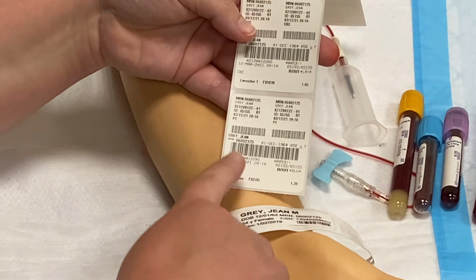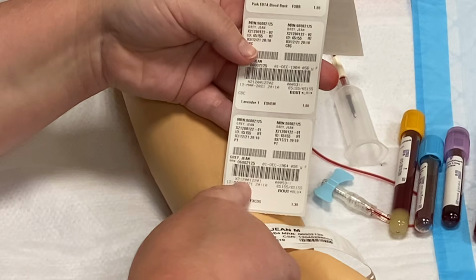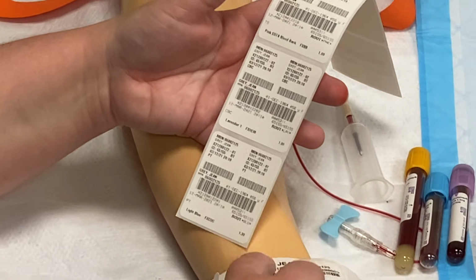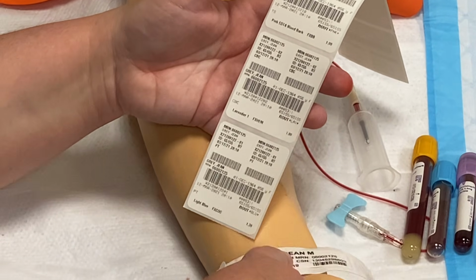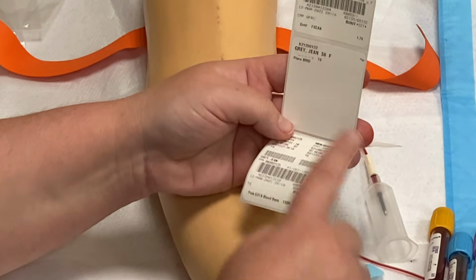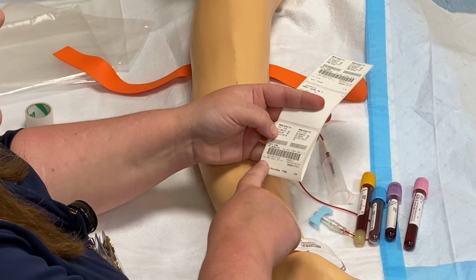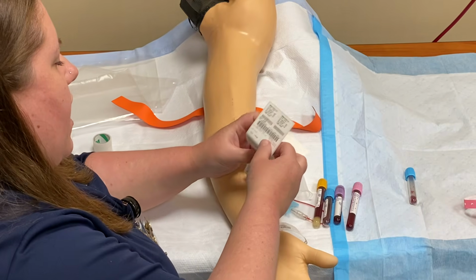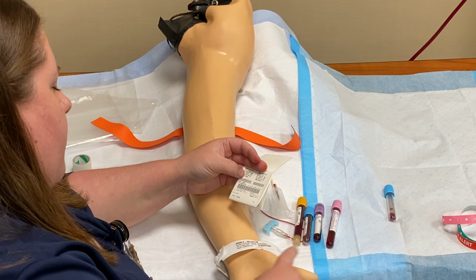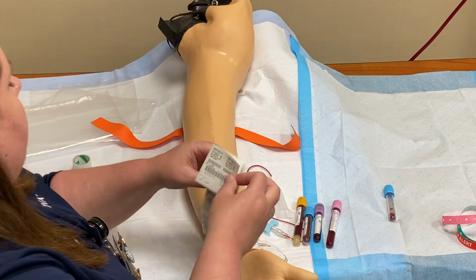So on my light blue label, I have Jean Gray, final 4, 2125, today's date, the time, and my U number. On my lavender label, I have Jean Gray, final 4, 2125, today's date, today's time, my U number. On my pink label, I have Jean Gray, final 4, 2125, today's date, today's time, my U number. And on my last label, my gold label, I have Jean Gray, final 4, 2125, today's date, today's time, and my U number. So I've checked all of my labels, they look good.